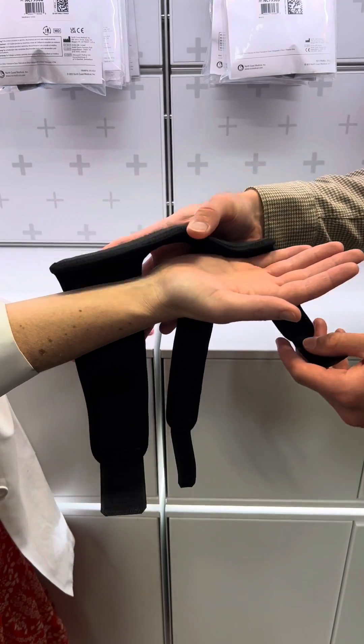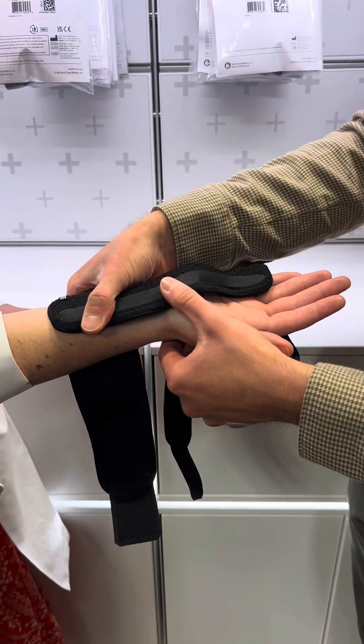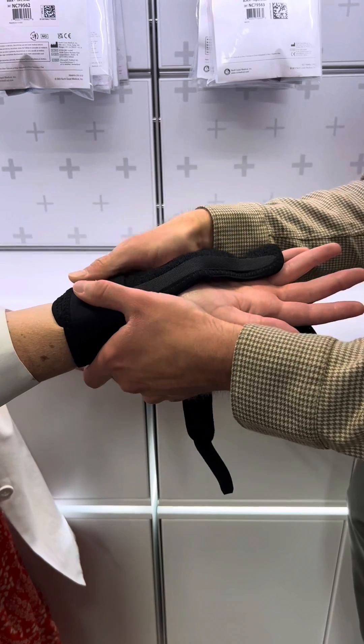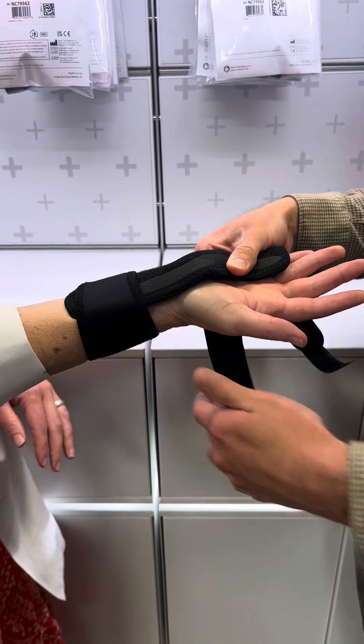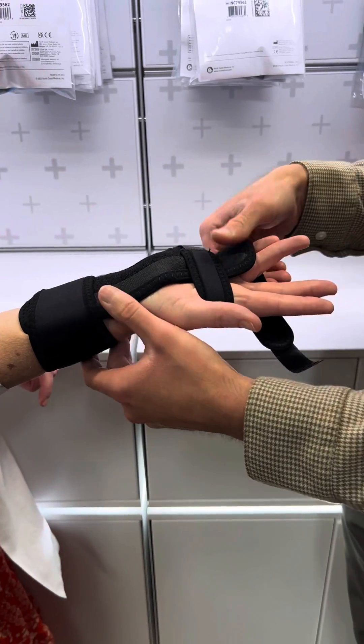Place the patient's hand palm up and the ulnar gutter splint on the palmar surface. Start by wrapping the strap around the wrist and molding the splint to the wrist — snug but not too tight. Take the next strap and wrap that through the first web space.